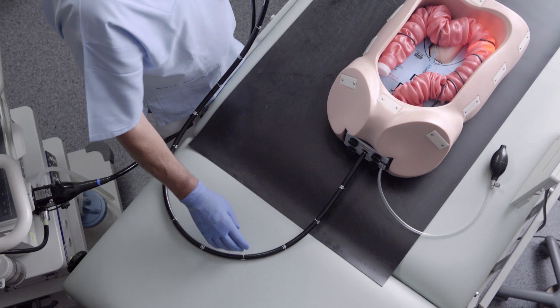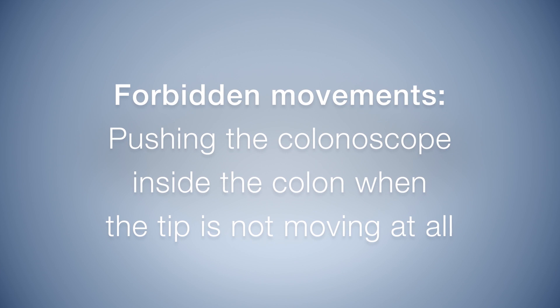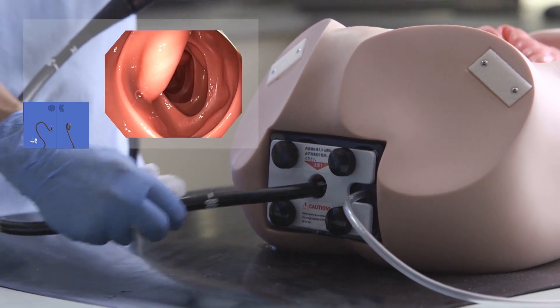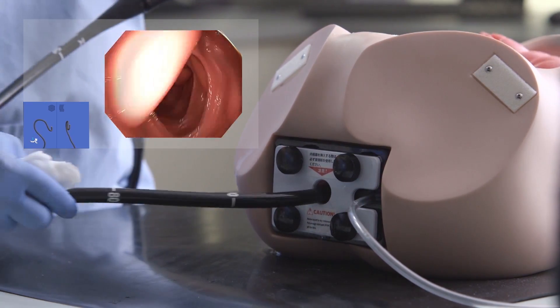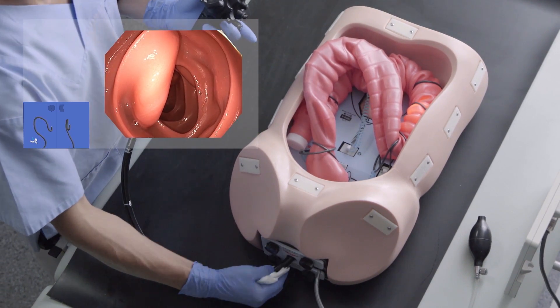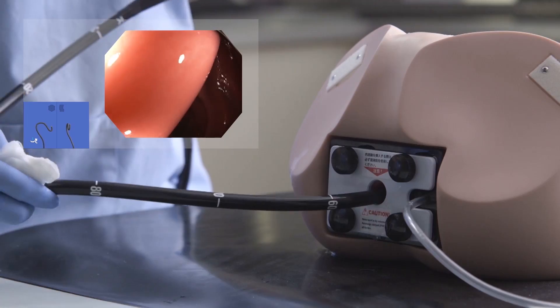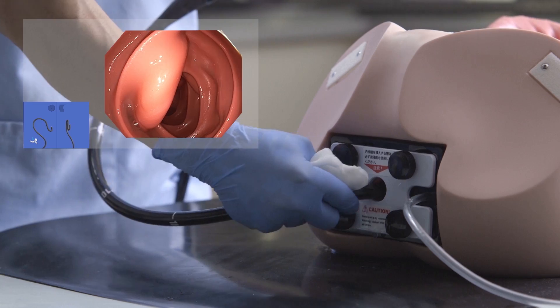The correct way to reduce a loop is by rotating the shaft of the instrument, slowly. And lastly, don't push the colonoscope too much. You see the inside of the lumen is not moving, but you still try to push. What is happening is you're making a huge loop inside the abdomen, and this is very painful for the patient. So when you see this movement in the colon, you should not push further.